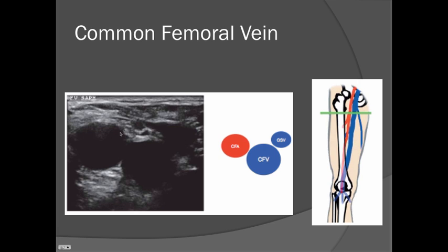And then another thing to keep in mind is when you would actually be looking at this on a live video image, this vessel here, the common femoral artery, might be pulsating as well, and that's an easier way to distinguish between the veins and the arteries.